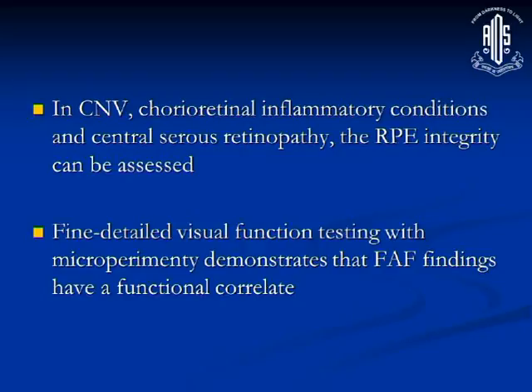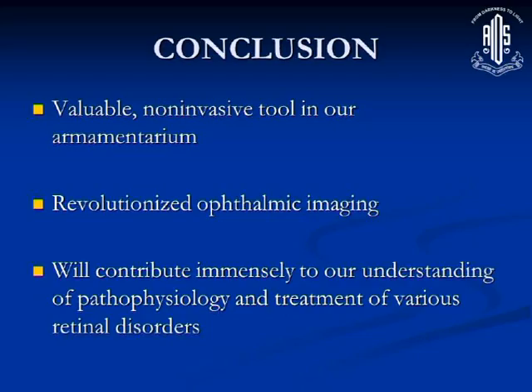So to conclude, it's a valuable non-invasive tool in our armamentarium which has revolutionized ophthalmic imaging, and definitely in the near future it's going to contribute immensely to our understanding of pathophysiology and treatment of various retinal disorders.